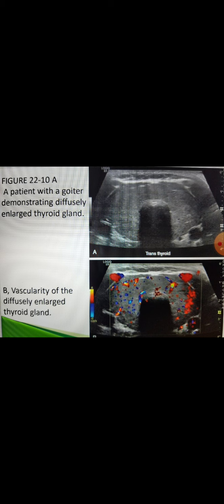The echogenicity of the nodules can also vary. These can be isoechoic, hyperechoic, or complex cystic, and this can be due to fibrosis of the nodules, focal scarring, ischemia, cystic degeneration or calcification formation.